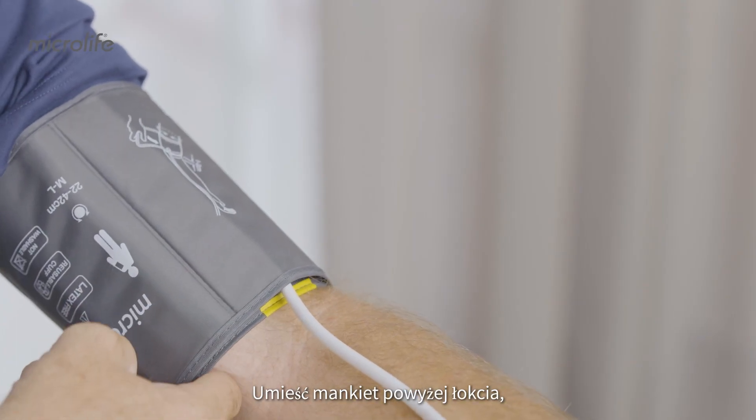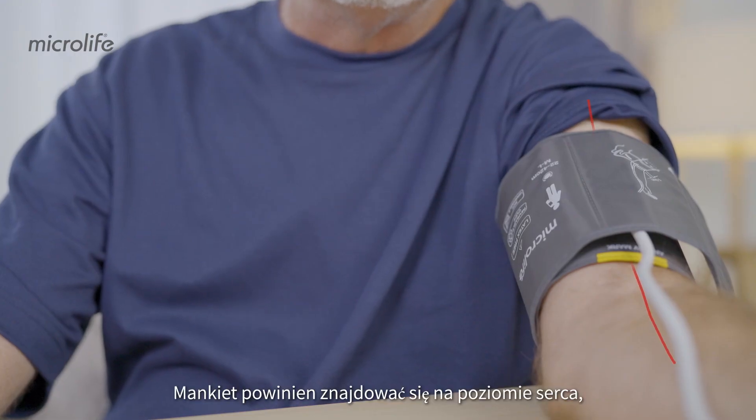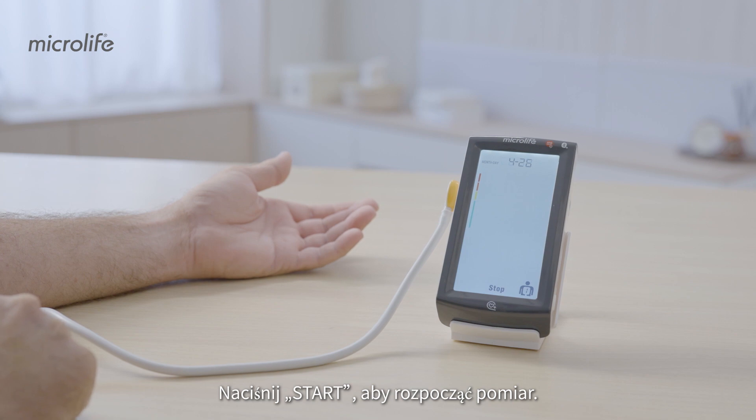Place the cuff above the elbow, then secure the cuff tightly. The cuff should be at heart level, with the artery mark aligned with the brachial artery. Press start to begin measuring.